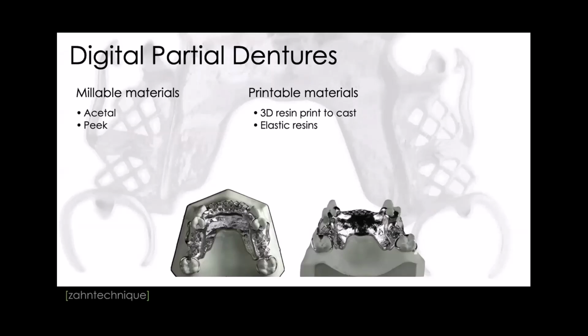By the way, these printers are like $500,000 to $1 million printers. It's insane. They're huge to print little partials. You have to have a lot of partials to actually make that ROI back. But they're fitting nice, they look good, they're really nice. I want to go more deeply into these millable materials versus printable materials. I want to explain a little bit more about my experiences with them over the last years. They may be different than what you hear in the industry or in literature. I just tell you my experiences.